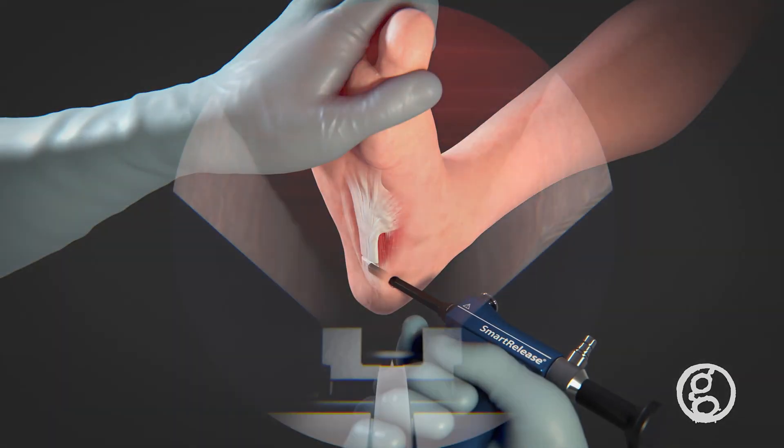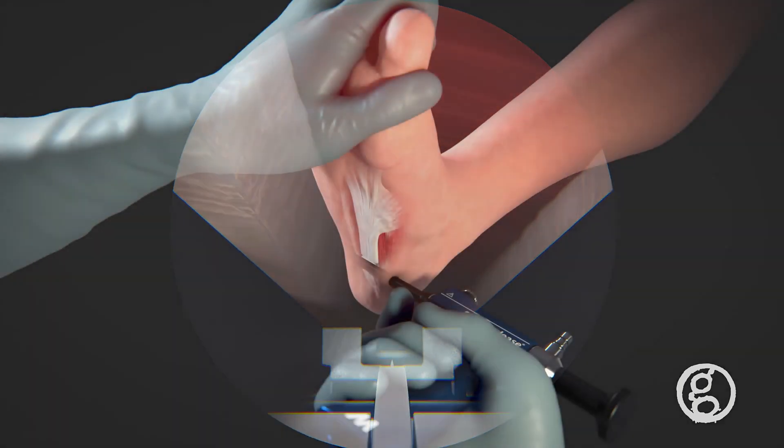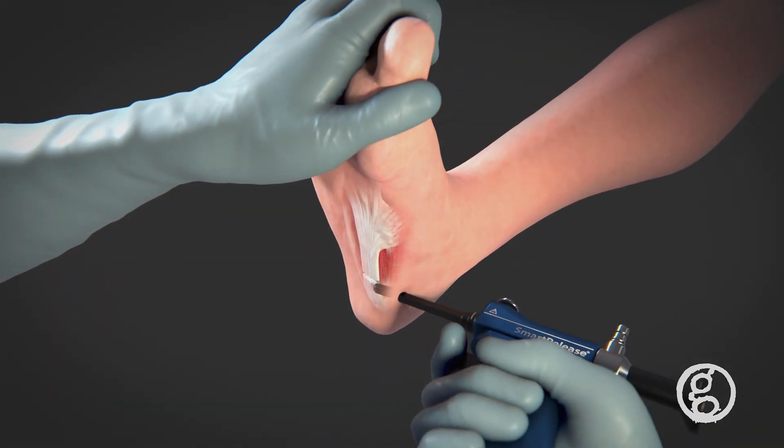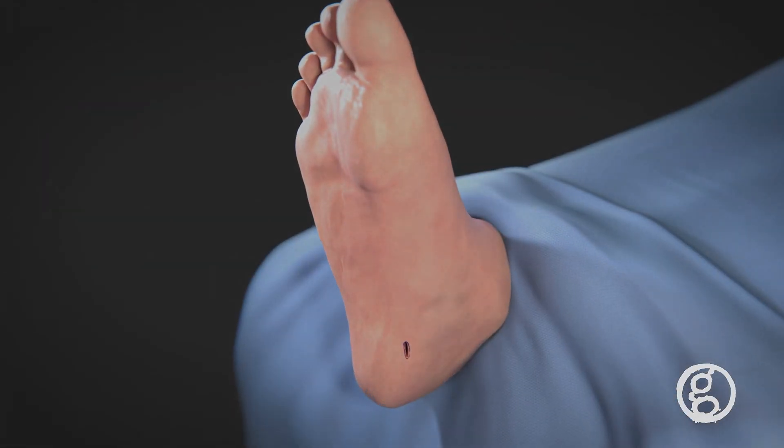The fascia is cut by pulling the trigger and deploying the cutting blade. A complete release of the medial and central bands is verified by inspecting the incised plantar fascia. Once complete, the device is removed and sutures are used to close the wound.